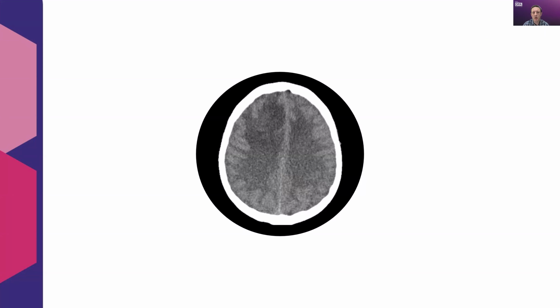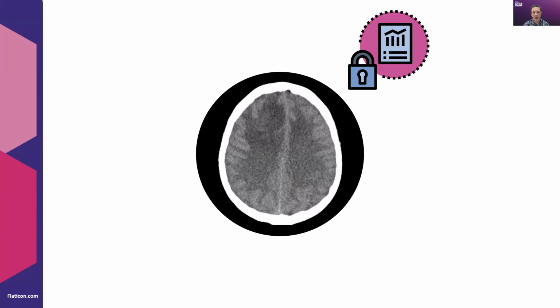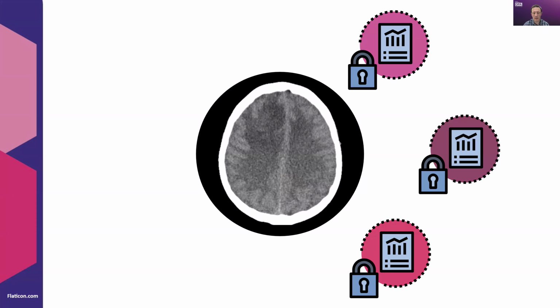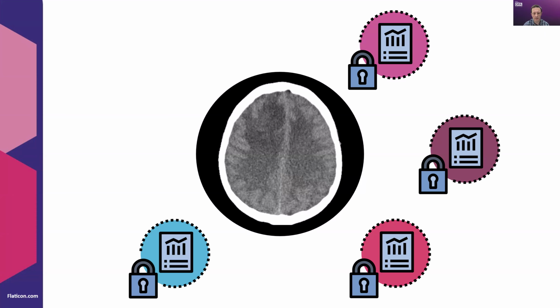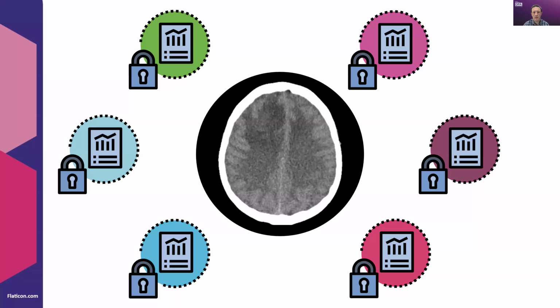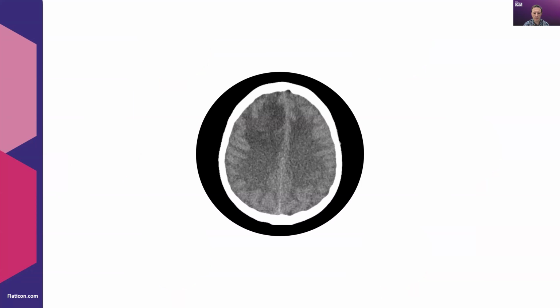And as radiology grew up, we started learning about a problem. As we grew into the digital space, we had devices sending out that proprietary information, and every machine had its own format. All the different vendors had their different flavors of the imaging that they were sending. One organization may end up with multiple scanners and no way to view it all, but radiologists needed a way to view all the images in one place. And that's where DICOM was born out of.